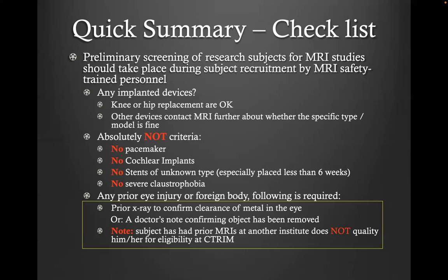I just want to further point out here, because we've turned away patients on the site because they are not MRI safe. That's a waste of coordinator time, subject time, as well as MRI scanner time and our technologist time. Also, for contact lenses, most contact lenses are fine, the corrective ones, but there's a special kind. It's the color contact lens, the circle contact lens. They are not MRI safe. So just ask them to take it out. And again, you can contact me, and we have a quick screening checklist we can share with you, as well as the full MRI checklist that you should screen way ahead of time before bringing your subjects.